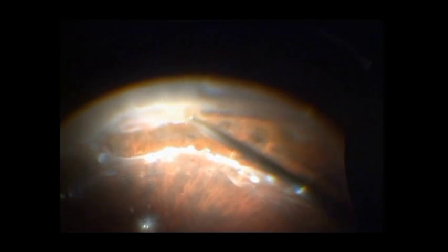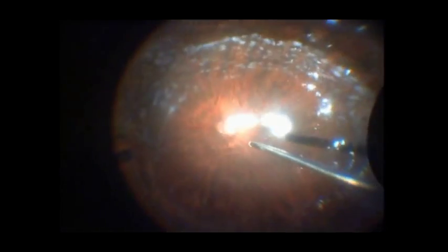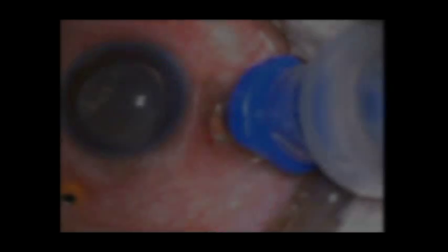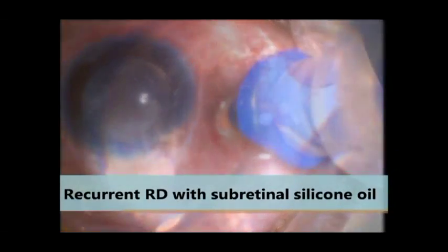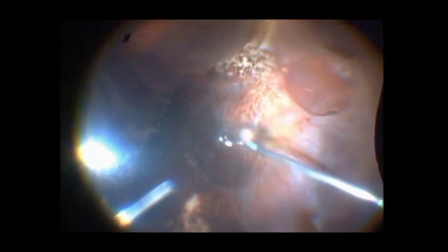The peripheral extents of the residual retinal flaps are trimmed with the cutter. This is followed by endo laser to the retinectomy margins.